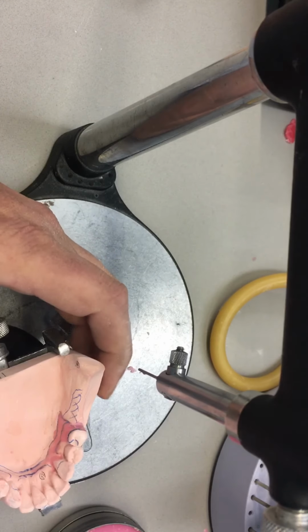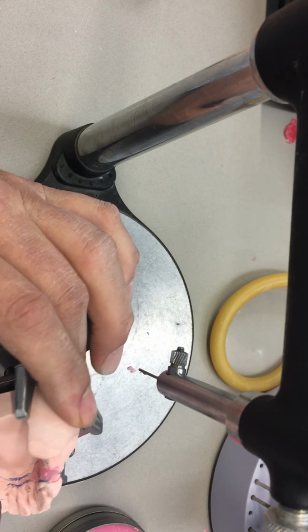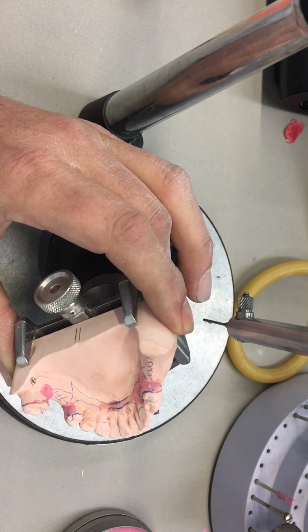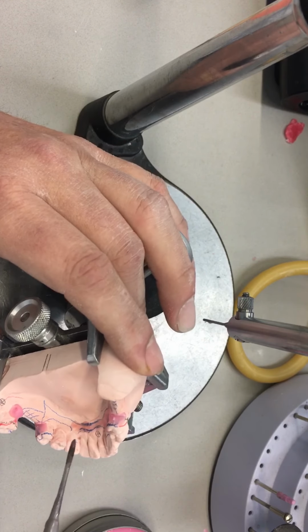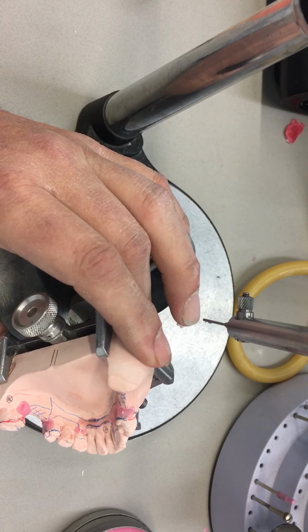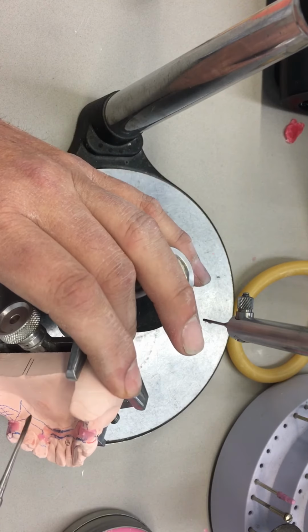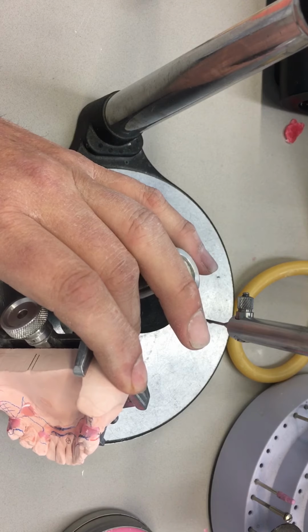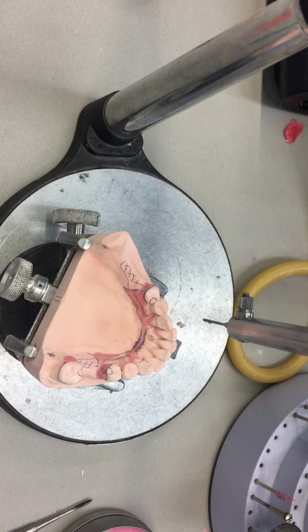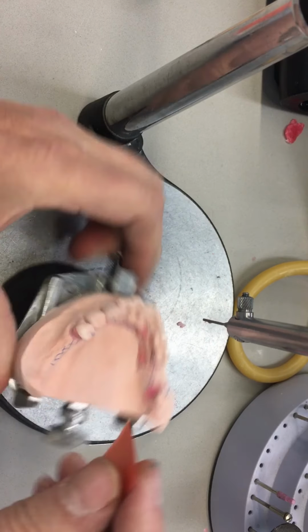So I'm going to put a very, very thin blockout wax on the lingual bar, on the free gingival margin of the apron of 3-3 and 4-3. And then last but not least would be my spacer blockout for the acrylic denture base, the mesh retention, in the free end of the Class 2 and of the dentate side of the modification.